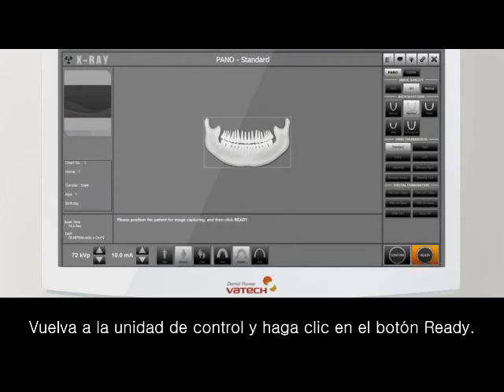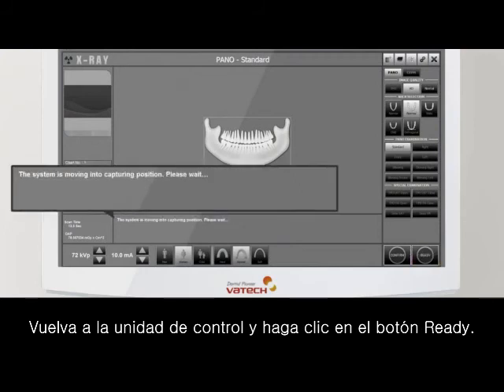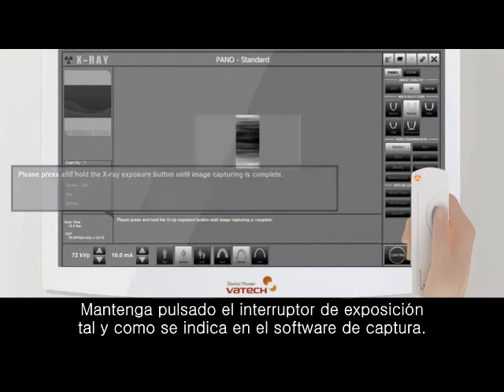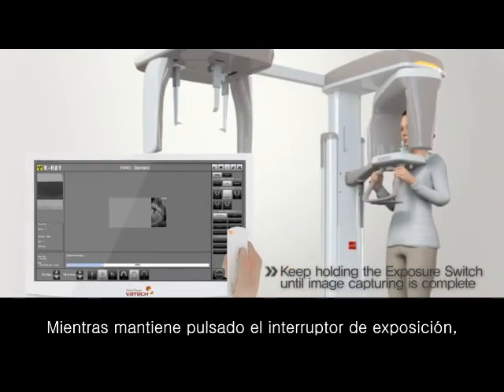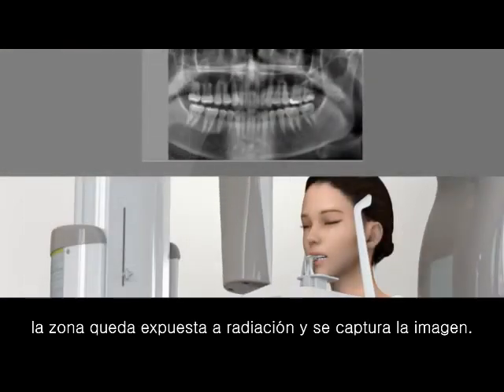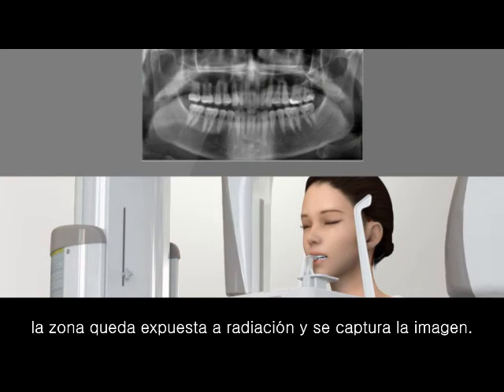Go back to the control unit and click the Ready button. Press and hold the exposure switch as guided in the capture software. While the exposure switch is held, radiation is exposed and the images are taken.